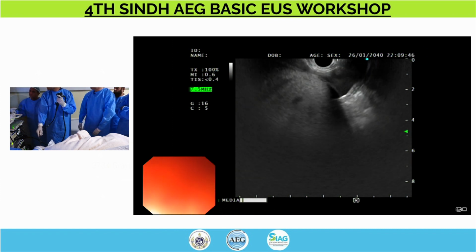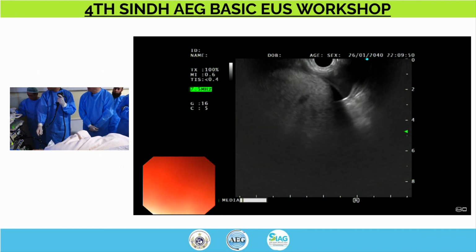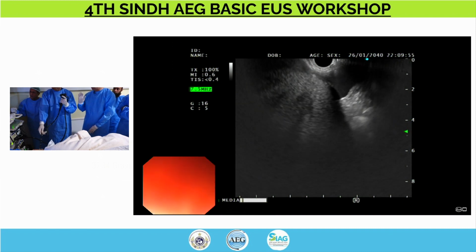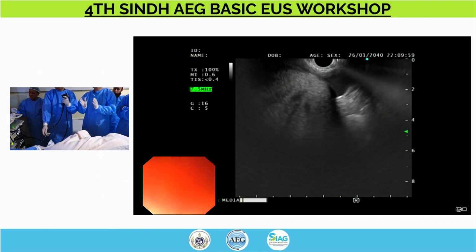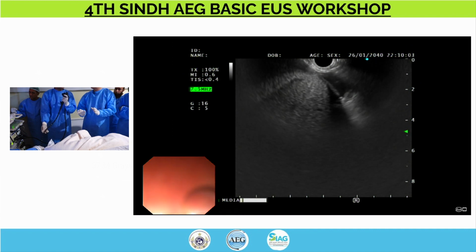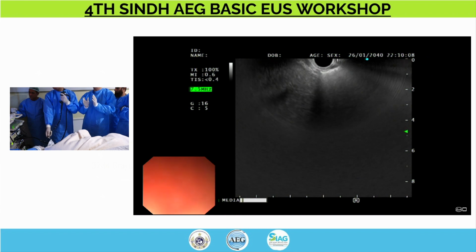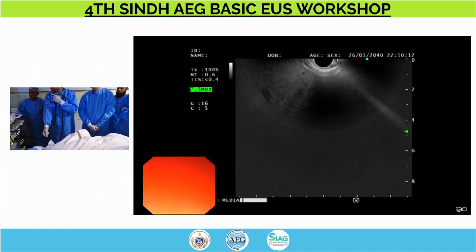And for that, the best thing is to blow up the screen. Okay, now what do we do? Look, what you want to learn at this time is the clinical methods. So follow the clinical methods, forget about the diagnosis, forget about the specific thing that we are looking for. Right now your mandate is to perform the clinical methods, so kindly perform the clinical methods.